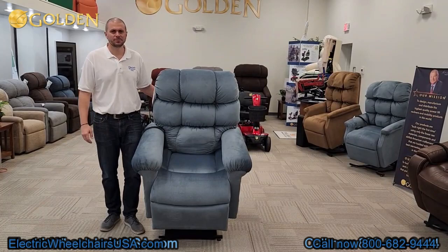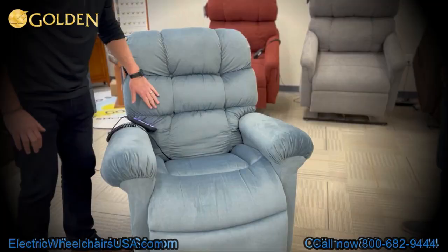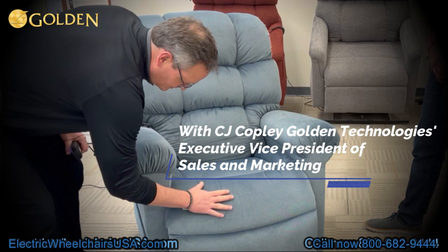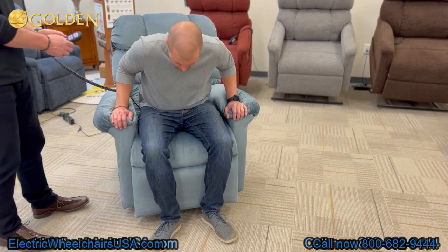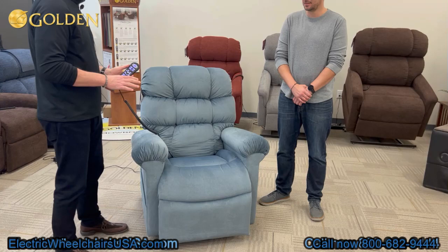Welcome to the Electric Wheelchairs USA Mobility Experts channel. In this video, we're going to talk about the Golden Technologies Cloud Maxi Comfort with Twilight. It's model number PR515. It comes in a small, medium, and medium-large size, which supports up to 375 pounds. It's an awesome product — let's get into it and show you how it works.